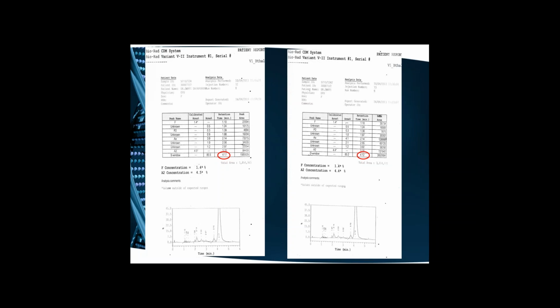Now everything could be explained with the HbD. Why was she not having a high HbA1c? Because her normal HbA was very, very low, so HbA1c would not be detected. Whatever glycated form is there is of HbD, so it will have its own different properties and would be difficult to assess.